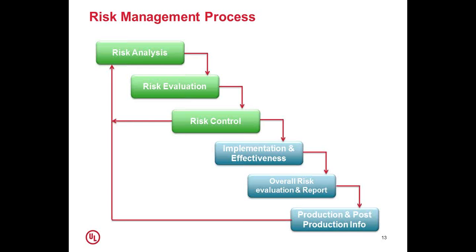For example, as I showed you in the Santa Claus picture, where the person is holding a pie and trying to jump onto the balcony, we are going to assess what is the severity of the person falling from that position and what is the probability of him falling. As we discussed, if we consider that the person is falling from the 27th floor, then the severity is going to be high, and probabilities we will have to determine. Based on this, we will do a risk evaluation.